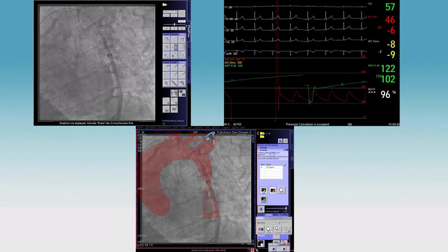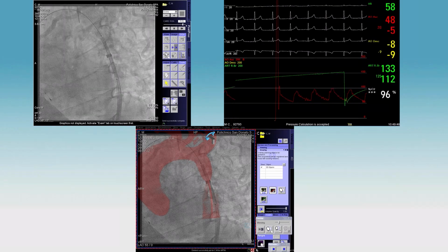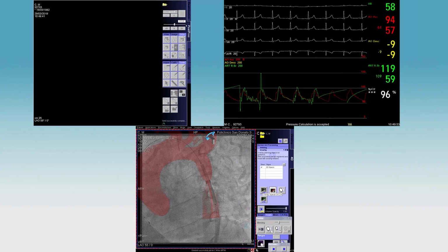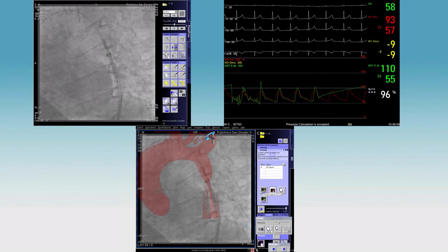Okay, so that's half exposed, and the sheath is pretty much at the coarctation point. The landmarks are the two ribs there, and the coarctation is between the two ribs, in fact exactly where the Mullins sheath radiopaque tip is. So now we can expose the rest. Do you think, Carlos or Amy, are you happy with that positioning? Replay the last angio?